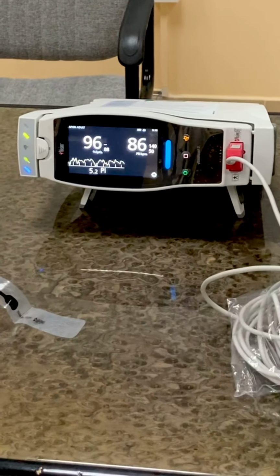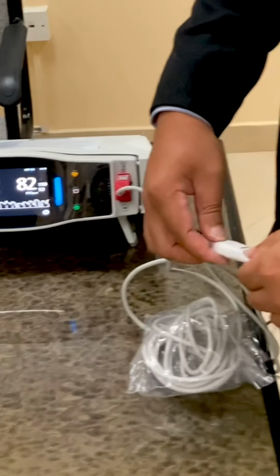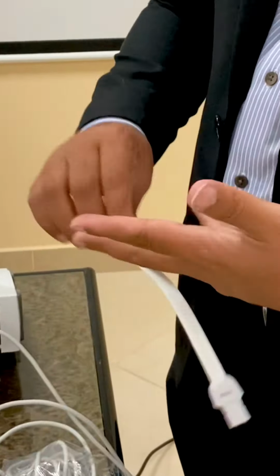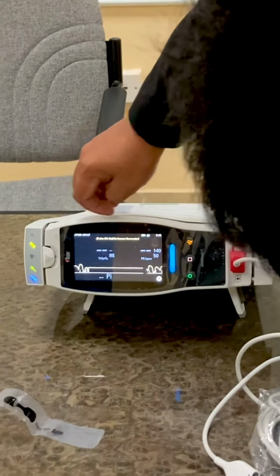So once you're done, just remove this cable and now it will start. Once the alarm is here, you can see it will start counting.